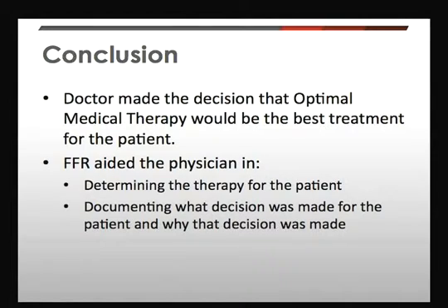Because she had T-wave changes, which we weren't sure were secondary to ischemia or reperfusion, we felt it was imperative to have a diagnostic angio to sort this out, and we're left with an intermediate lesion and a lack of clarity about how to proceed. Without FFR testing, I think it would have been very difficult, if impossible, to know for certain that you were making the right call.